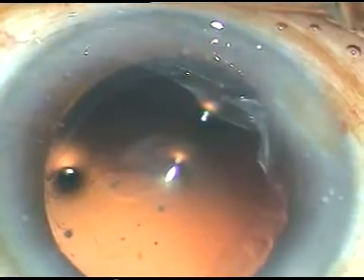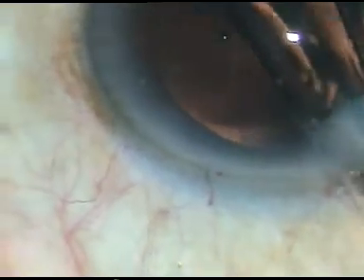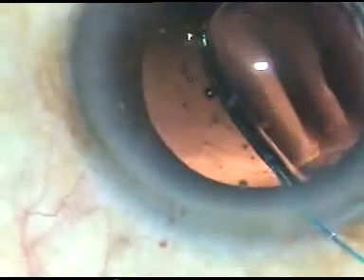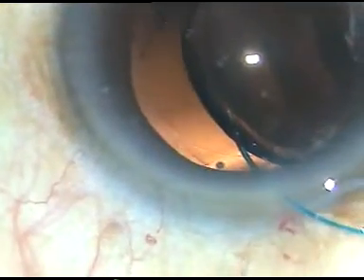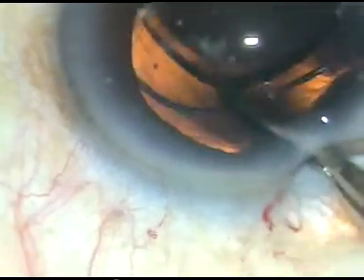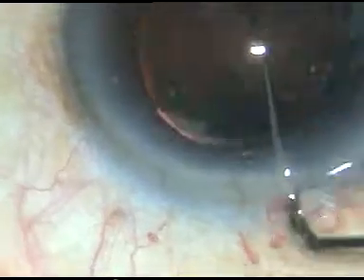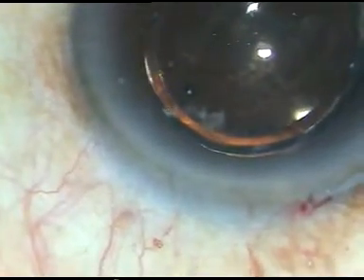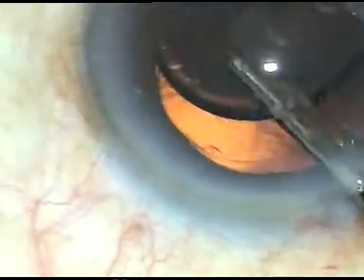Now I am going to inject a multi-piece intraocular lens. As I inject the intraocular lens, the leading haptic goes into the capsular bag and the trailing haptic remains outside. I hold this trailing haptic with the Mcpherson's forceps and push it into the capsular bag. Notice this white material sticking to the optic of the intraocular lens at 2 o'clock — this material comes from the lumen of the cartridge. Let's just flush it with Simcoe and it comes out.